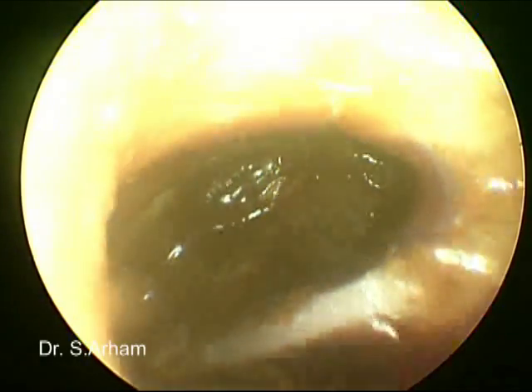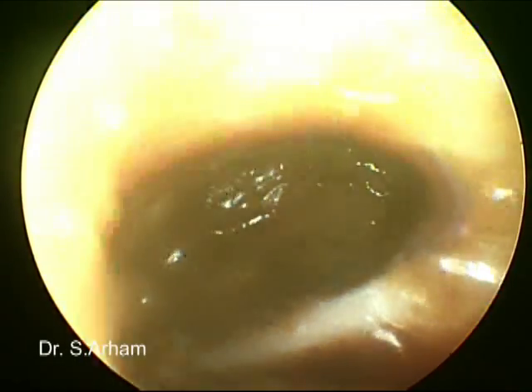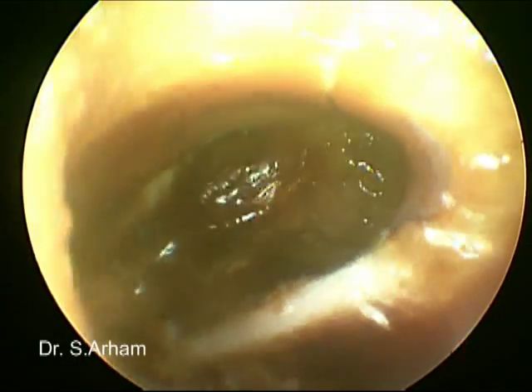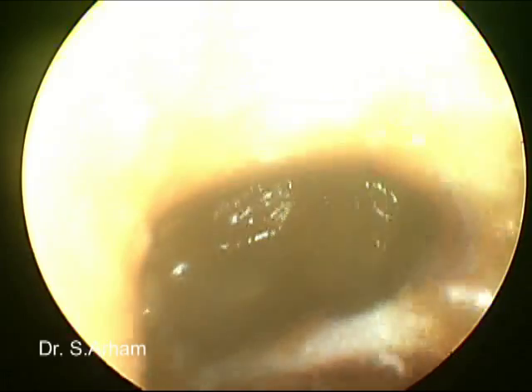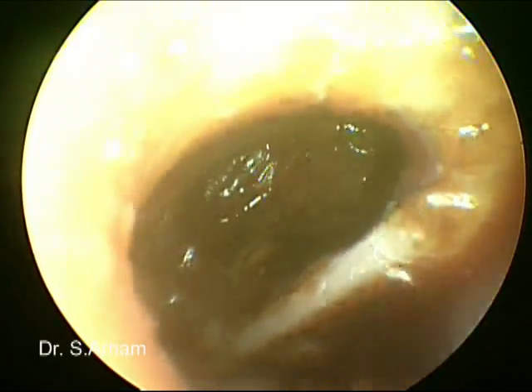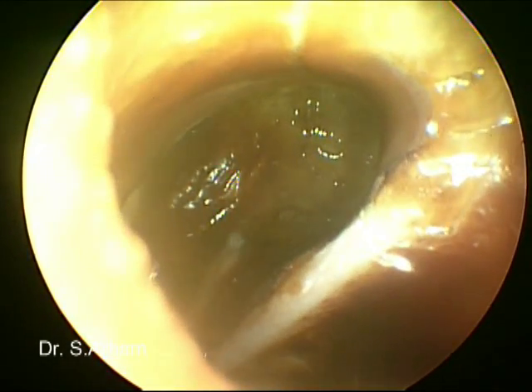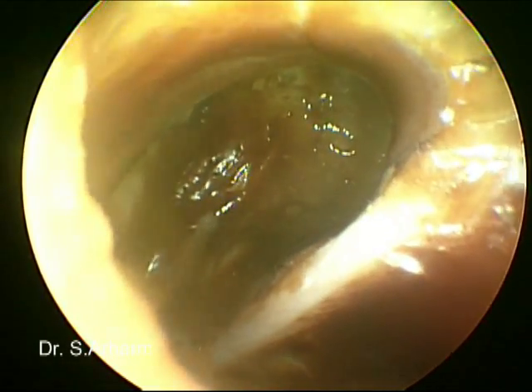This mastoid exploration was done endoscopically using a 2.7mm 30-degree endoscope.